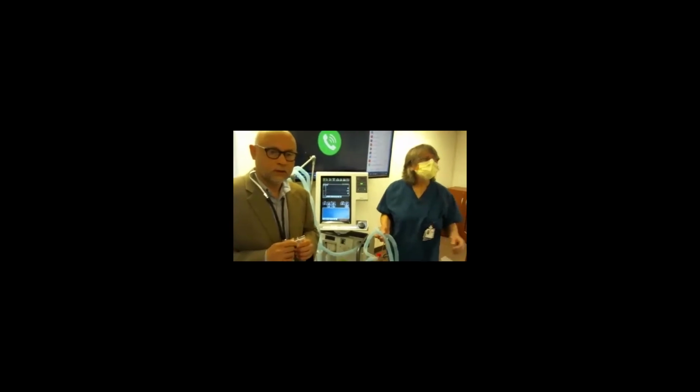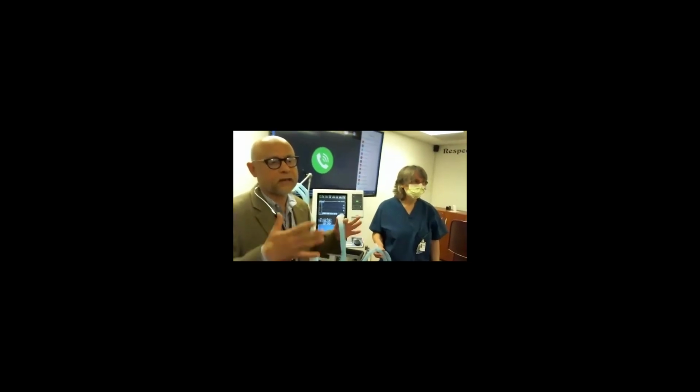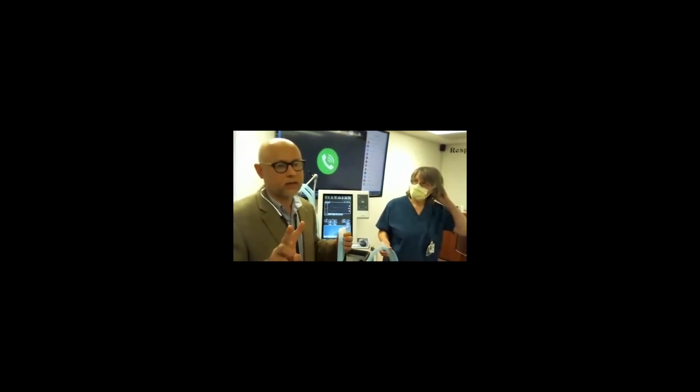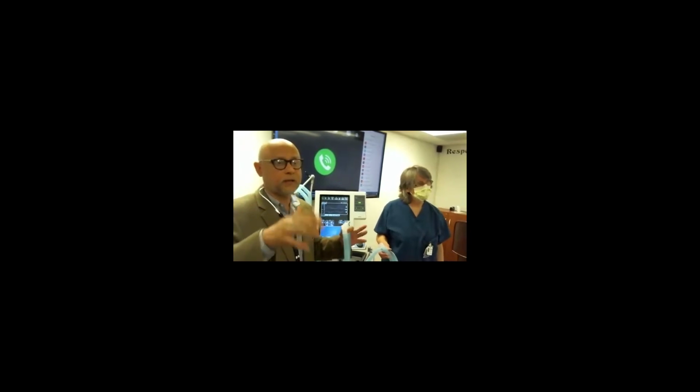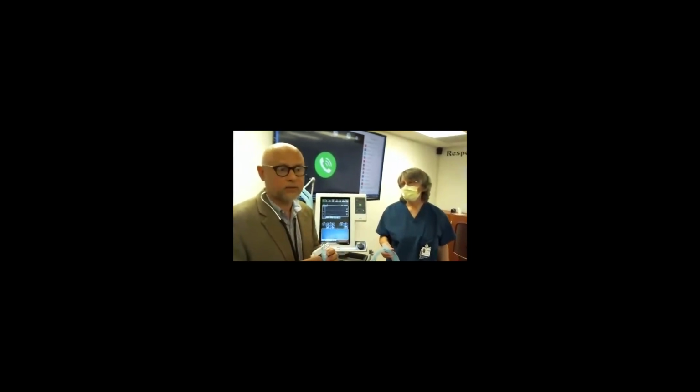So you'd have to go up to double the tidal volume. Yes, double everything, exactly. 4 people, quadruple the tidal. Yes, we can do 4 people too, but we have to have a bed. In ICU, we can have 2 only. I don't think we can have more than that. If we can find a place where we can have 4, we can do 4 too, but God help us, I don't know how that will happen, but we have to save life.